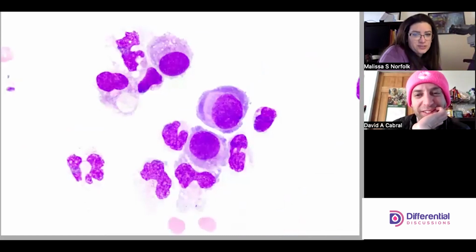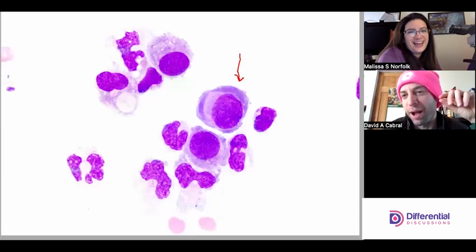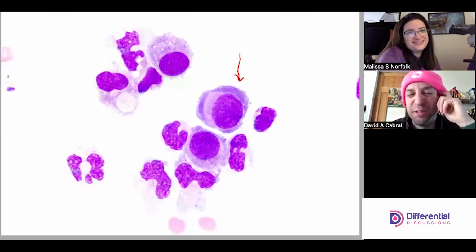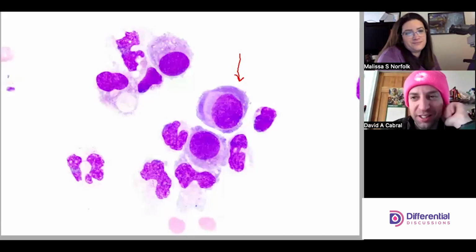Sit down, scan, look around, become comfortable with the cells, and then do your differential, so that you can say, these are this patient's mesothelial cells, this is this patient's macrophages. This mesothelial cell is the meanest for a practical exam. If you were to make an exam to purposely stump a student, not a plasma cell, definitely a mesothelial cell.